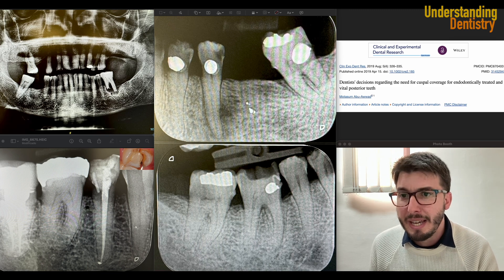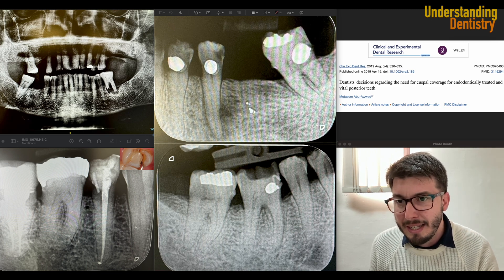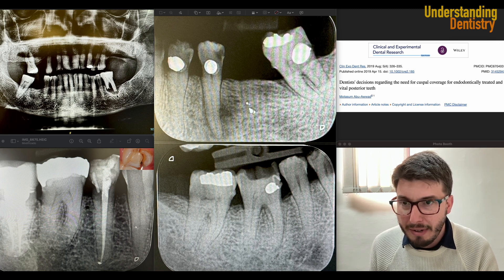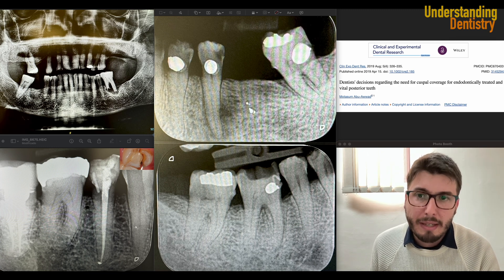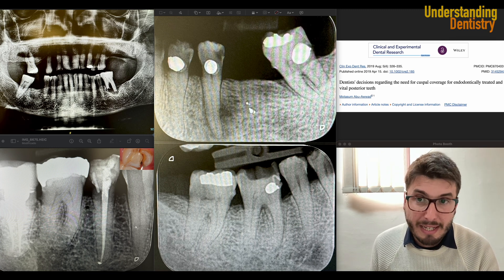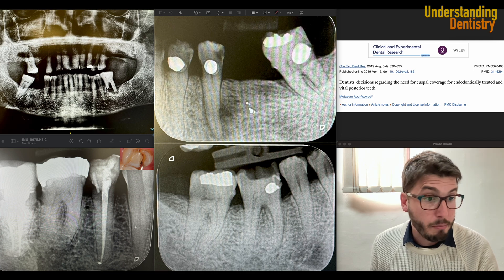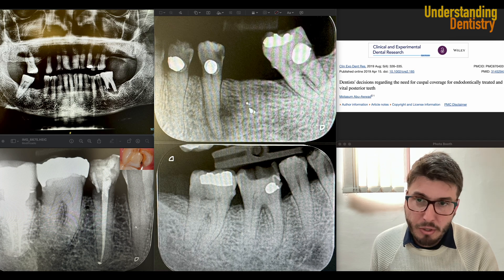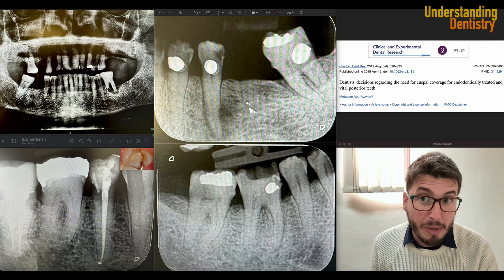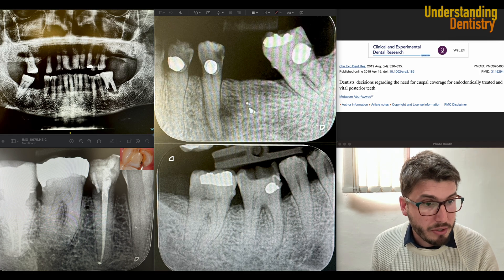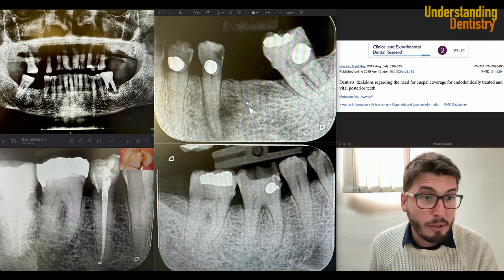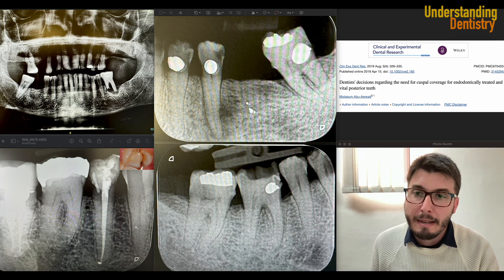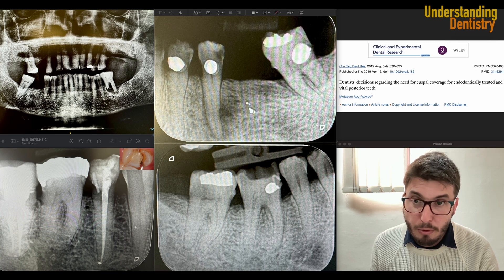It seems that we have the periapical lesion and the surrounding limits of this lesion in the bone are a little bit more radio-opaque, and this would be an aspect of condensing osteitis that happens sometimes depending on the patient. Sometimes you are going to see radiolucent alterations and sometimes radio-opaque alterations in response to inflammation — there are theories of inflammation explaining why it happens like this or like that.